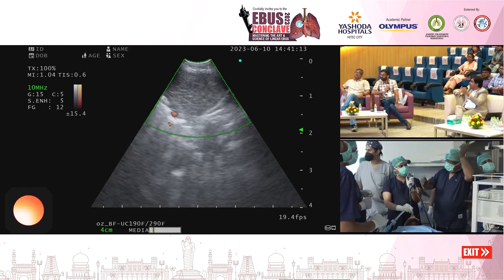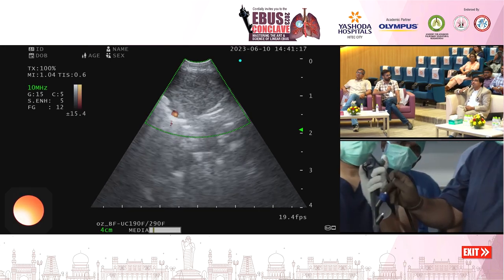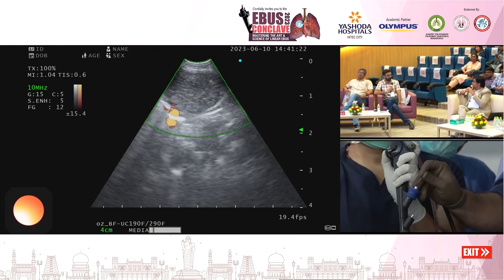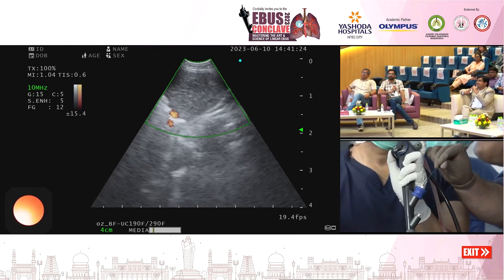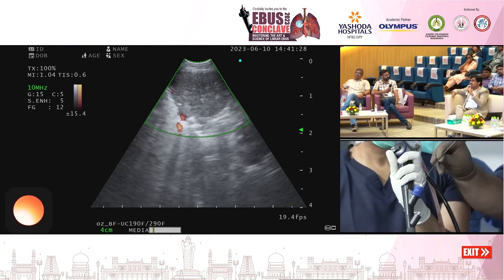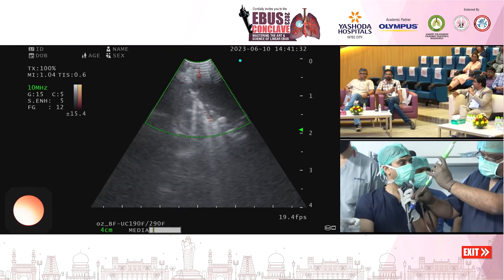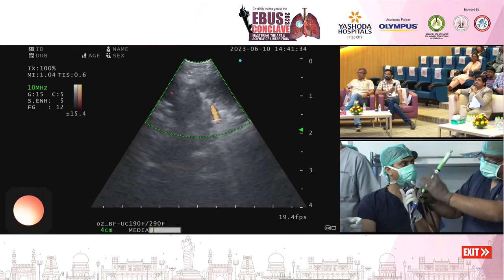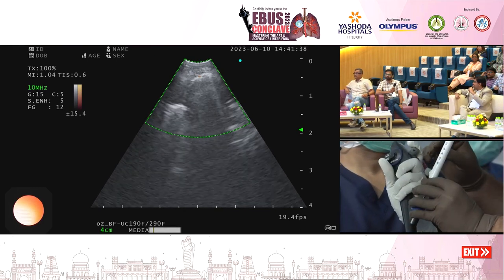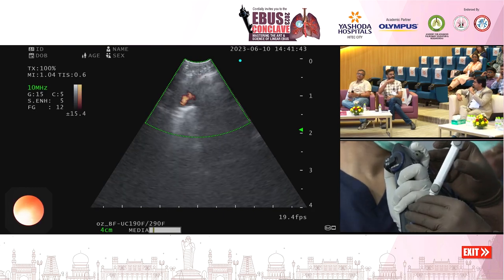Since the time we have access to the Acquire, if at all we want a needle biopsy, we use Acquire. The problem with the Acquire is the cost. I think this is something which we should also remember, that it is in the Indian currency at least 10,000 to 15,000, which is more costly than the Olympus needle. But if cost is not a constraint, then definitely you think this would score over. It would depend upon your preference also.